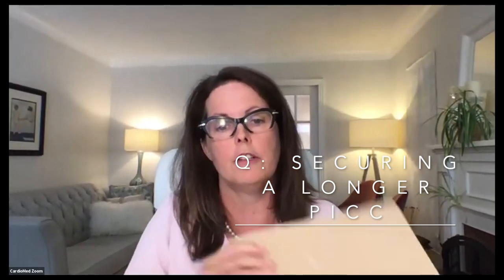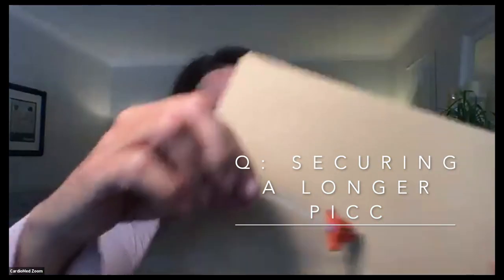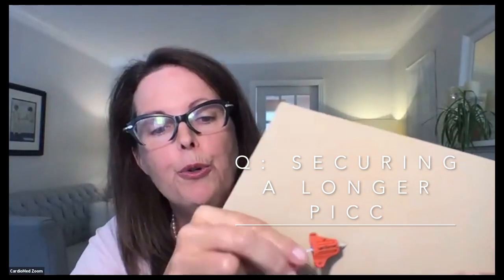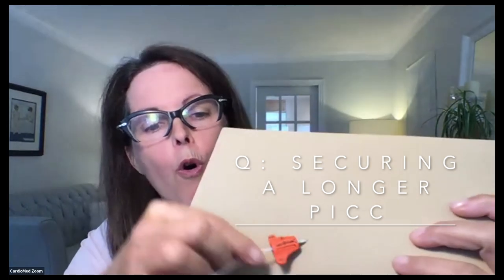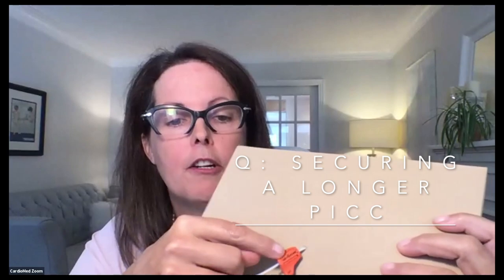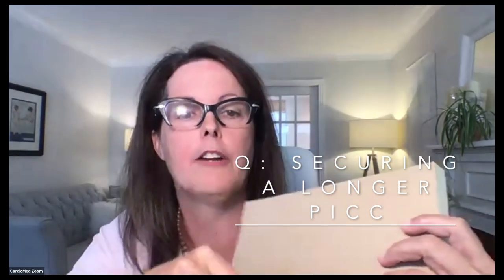I have another question for you, and I'm going to try to show it quickly here by putting together a demo board. So Michelle, if you did address this in one of your slides, when you have a longer external length, and this is just a demo board of course, do you curve the PICC like this, where you're bending the SecurAcath, or where would you bend the catheter so that you have both the SecurAcath and the suture wing under the dressing?